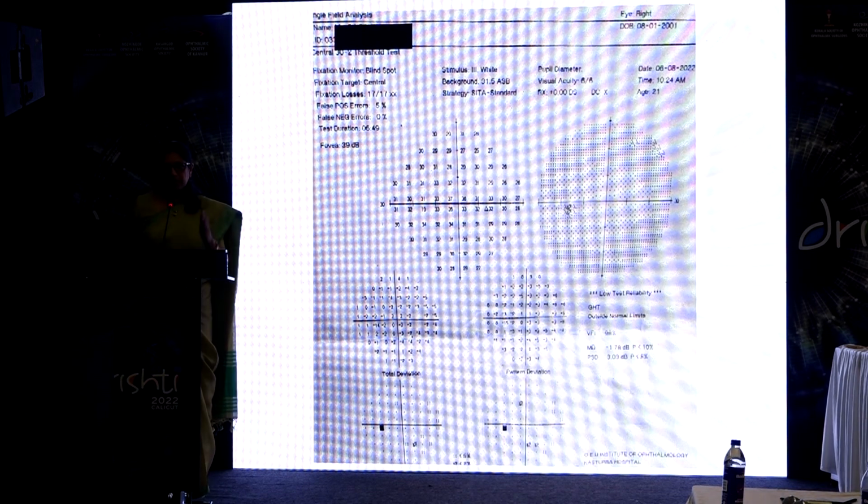So I went and talked to the optometry student and her friend who had done the test, and we found that they had forgotten to occlude one eye. So you can have surprises like this, where the right eye is entered, but the left eye is tested.